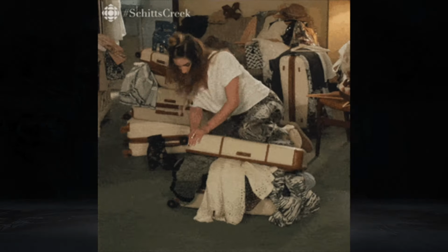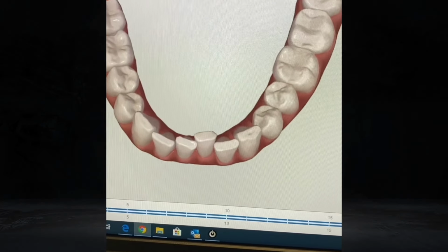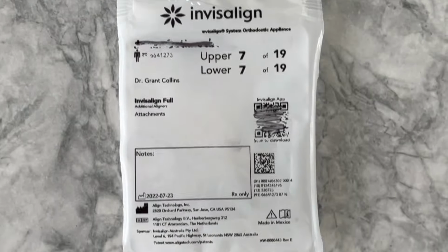Next tip, if you go on vacation, bring more than one set of aligners. What sometimes happens is you'll lose your aligners on vacation, whether you're at a restaurant or at a hotel. If you don't have anything in your mouth for a long enough period of time, your teeth actually start regressing and going back to their original positions. So I always suggest having a backup, meaning either your next set or your previous set.